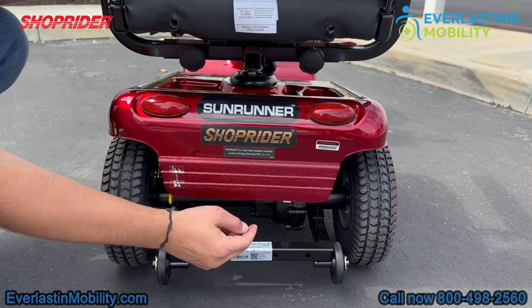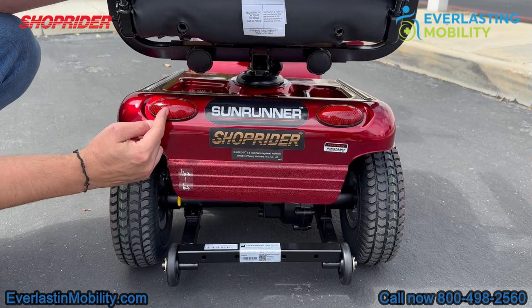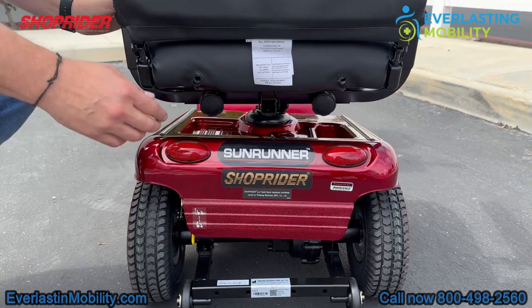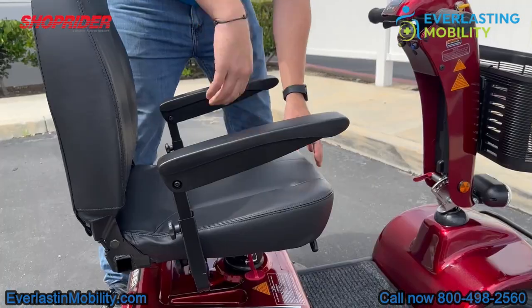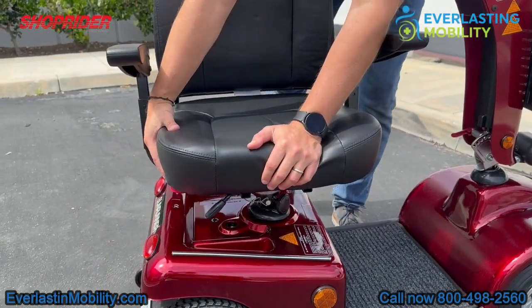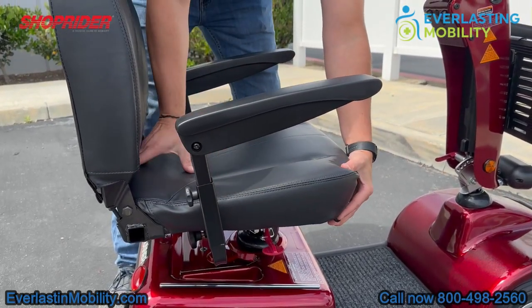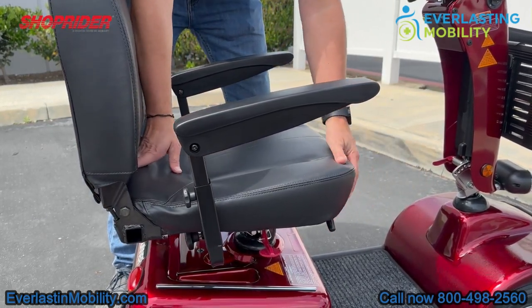These are two rear reflectors. With the Sunrunner, you can upgrade the lighting package to have turn signals or hazard lights, but it comes standard with a front headlight, which we'll show in a moment. The armrests flip up, making it easier to get in and out of the seat. There's also a lever on the right side of the seat — pull it up and you can swivel the seat 360 degrees. On the front of the seat, another lever lets you slide the seat forwards or backwards to get a comfortable driving position.